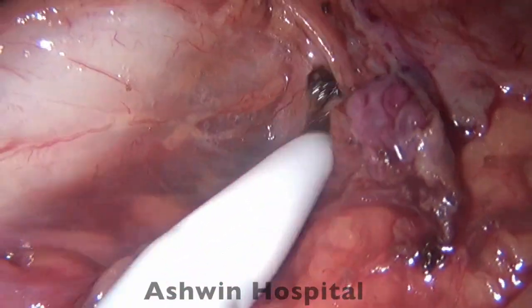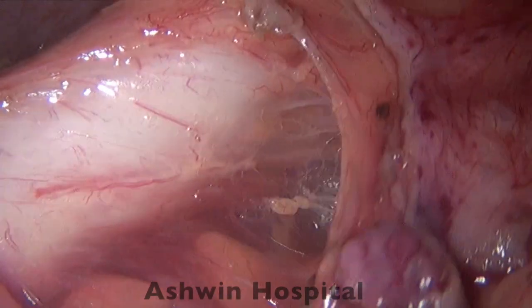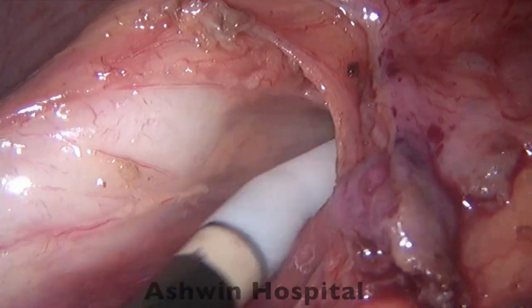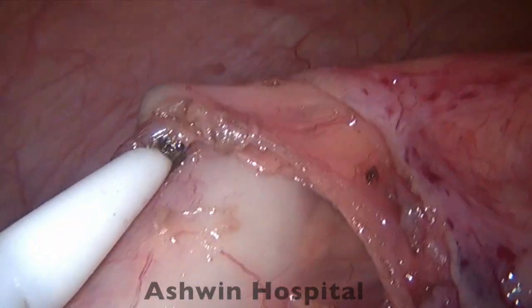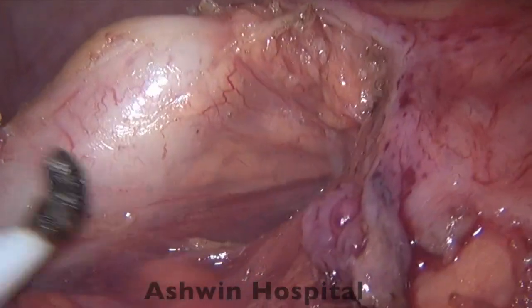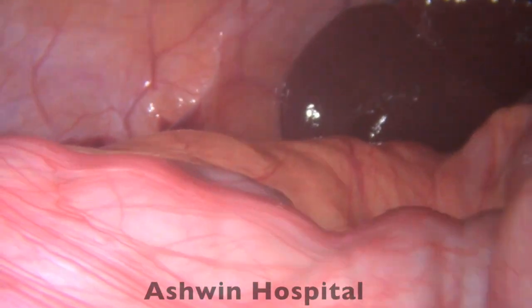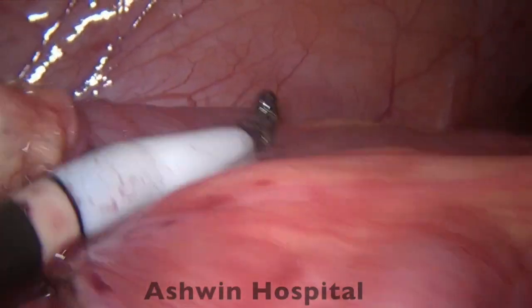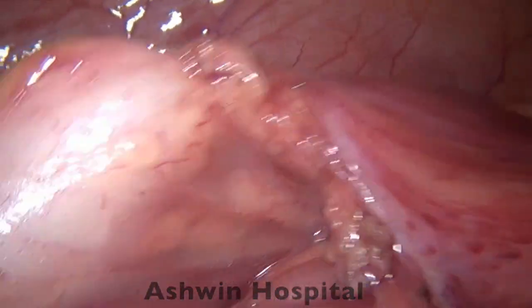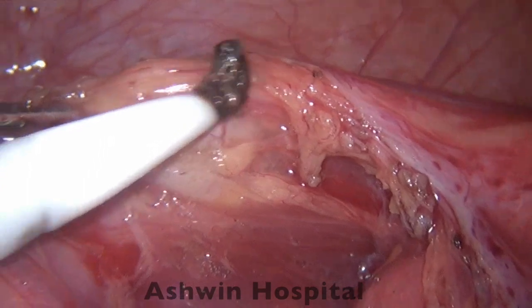We can now appreciate the area of the cecum, keeping it in mind so we do not cause inadvertent injury. Further blunt and sharp dissection combined take down the remaining attachments. The appendix is quite bare on one side and the tip is now better appreciated. We demonstrate a small gap between the structures, confirming a good safety margin for dissection without concern of thermal injury to the cecum.